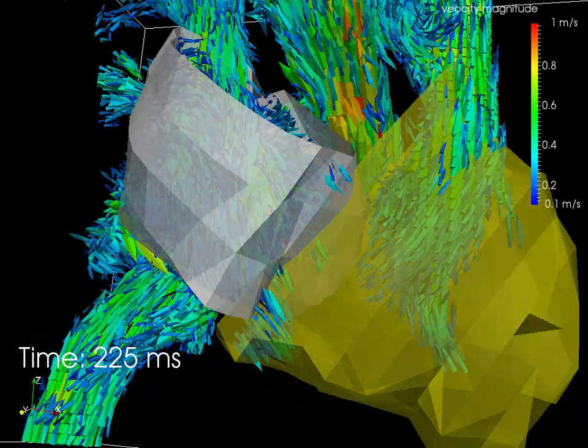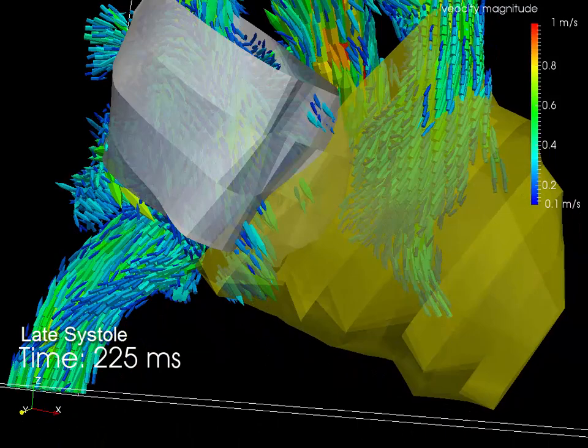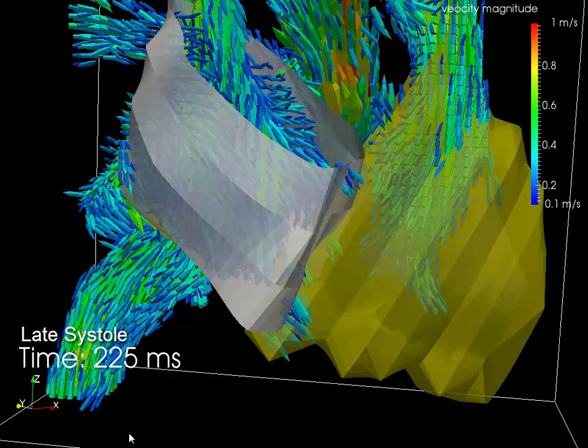We are going to focus on flow in the right heart. The atrium is in white and the right ventricle is in yellow.